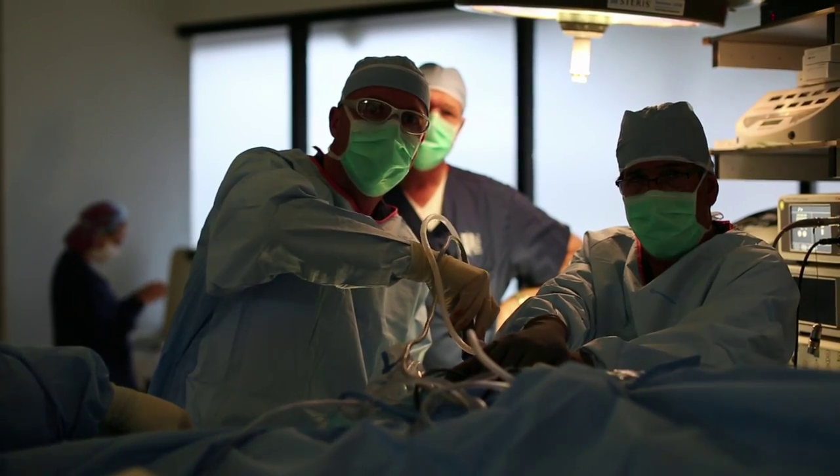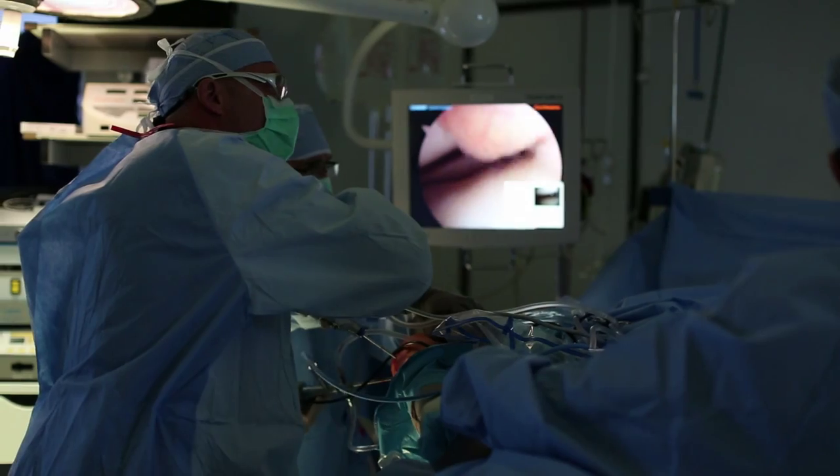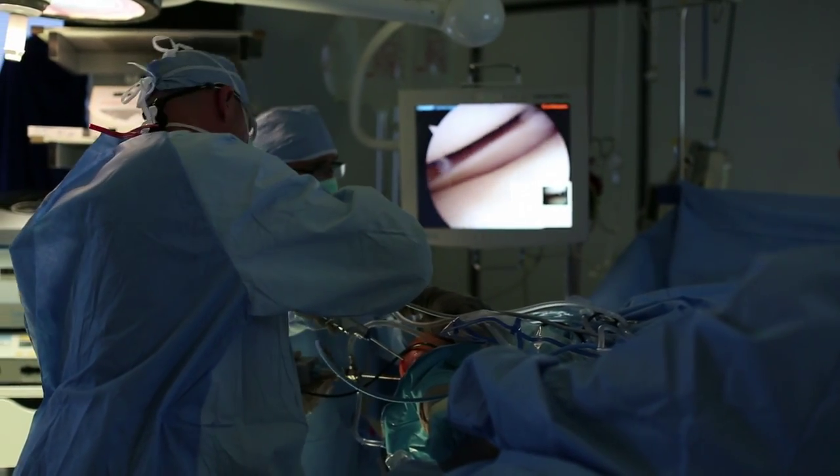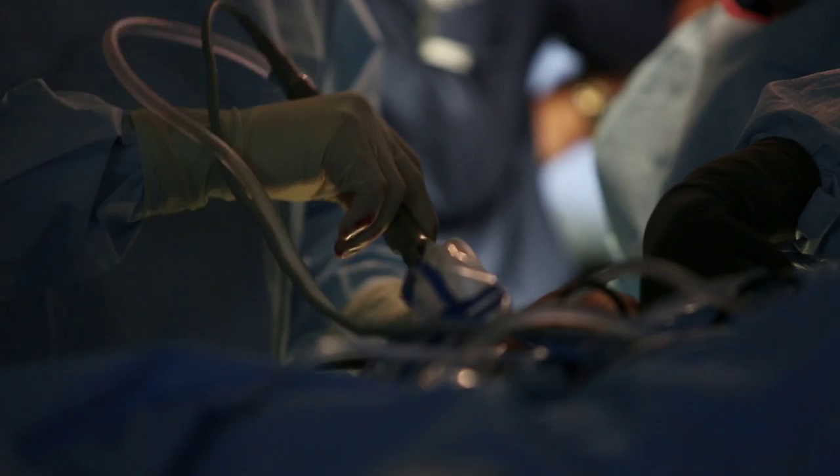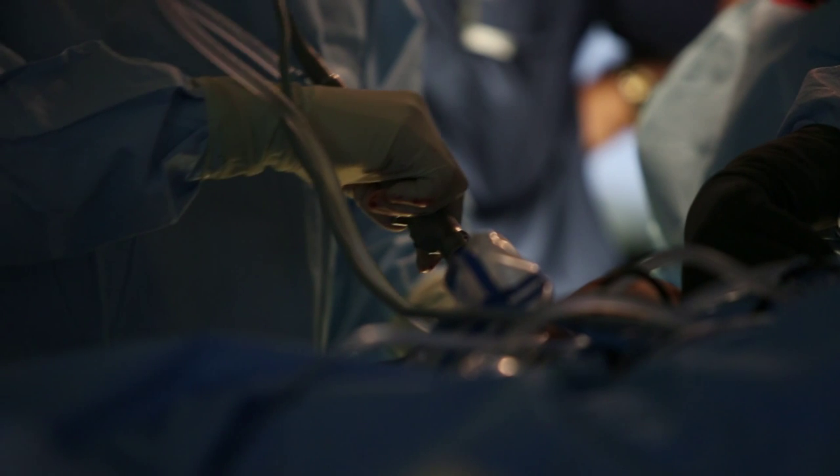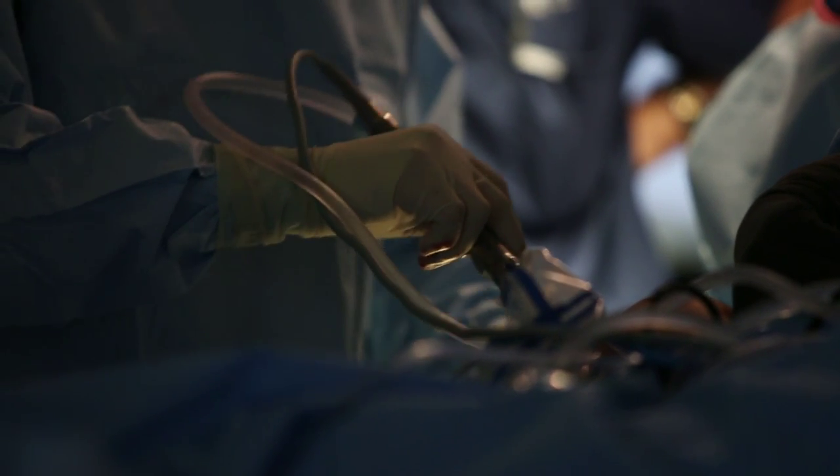MRI helps us diagnose various problems before surgery. In this scenario, arthroscopy allows us to correlate the findings on MRI and then actually confirm them during arthroscopy. Not only can we visualize the structures of the knee, but I can also put a probe on the different structures to evaluate — for example, a torn meniscus that may initially visually look intact.